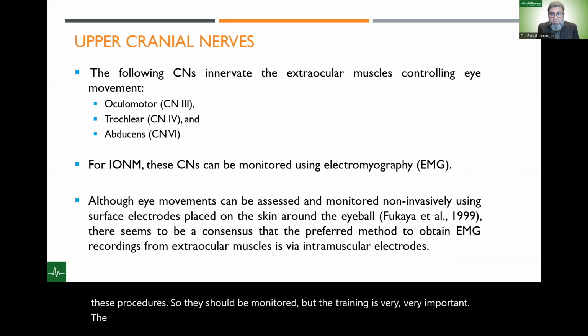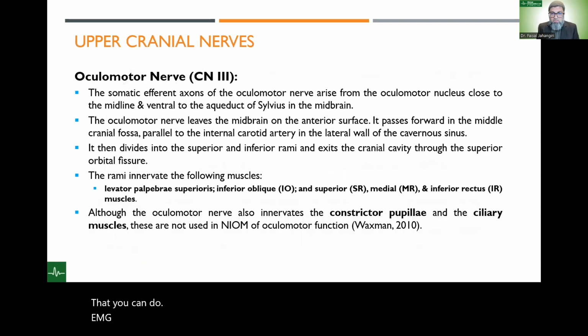That you can do EMG, trigger EMG, and many people have tried to do MEP as well. So oculomotor nerve is cranial number 3.